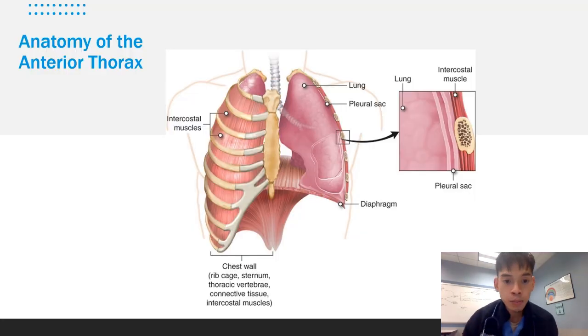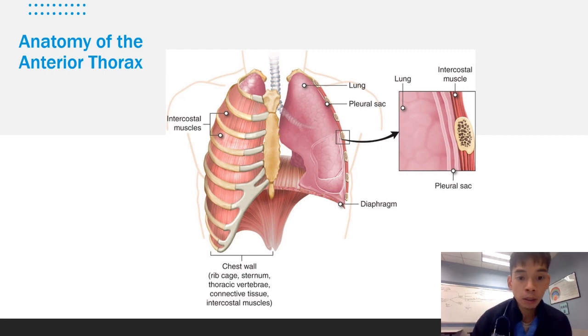So similar to the subxiphoid or the pericardial view, I'm a very big picture type of person, and I like to have these cartoon drawings so that we know what we're dealing with and then what we'll try to find when we're on the ultrasound machine, okay? So here on this right-hand side, let me go ahead and pull up the pointer, there are the rib cages, and it also shows the intercostal muscles, and then as you peel that back or reflect that back, you see the lungs.